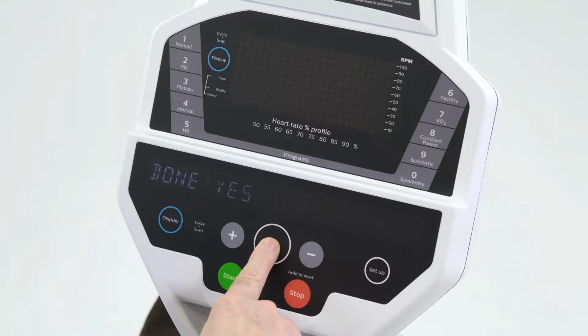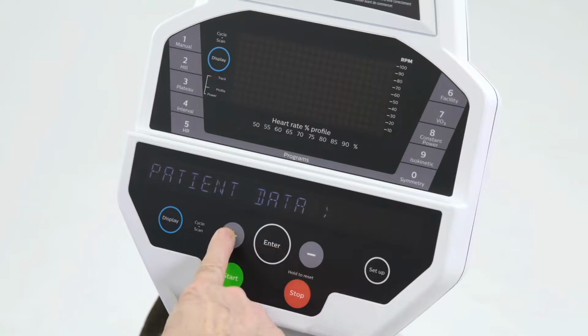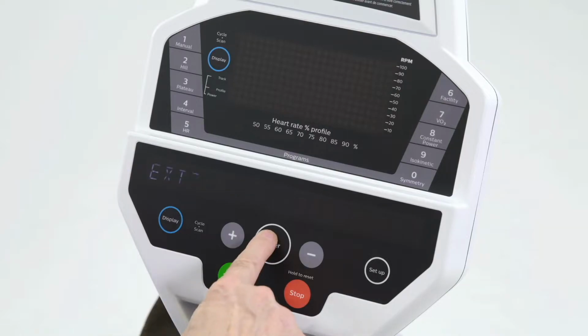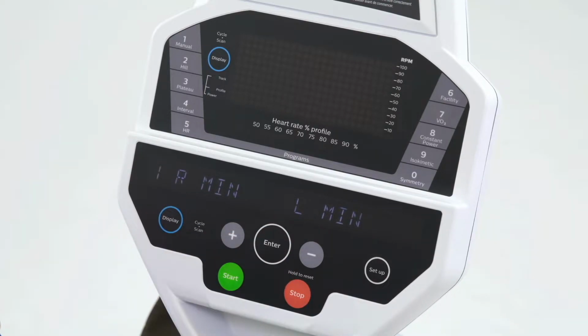So I'm done setting up all the patient data. I'm going to go to, well, why don't we go to the seat position function. This function allows you to enter the patient information like we just did, the user's height, and then be able to enter the patient's minimum and maximum knee flexion.